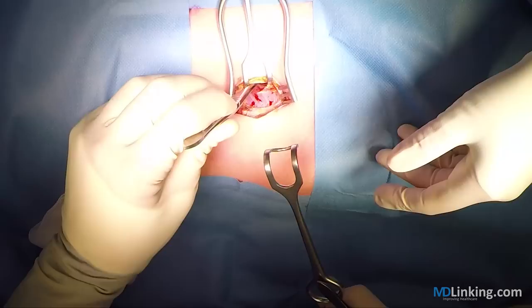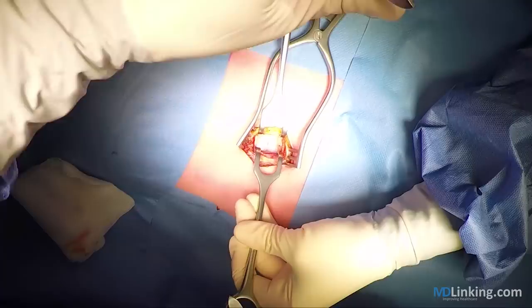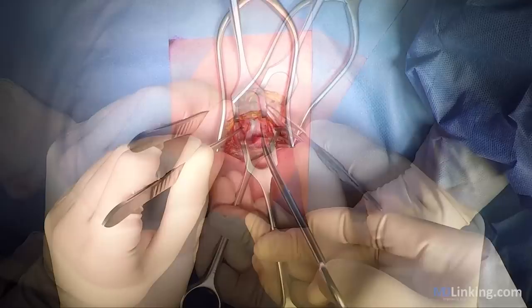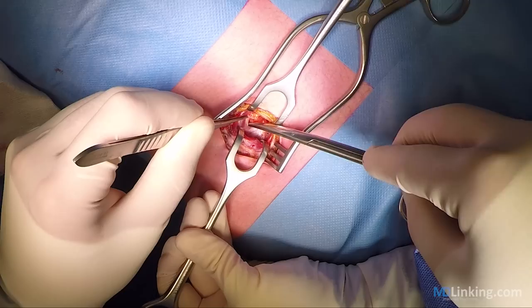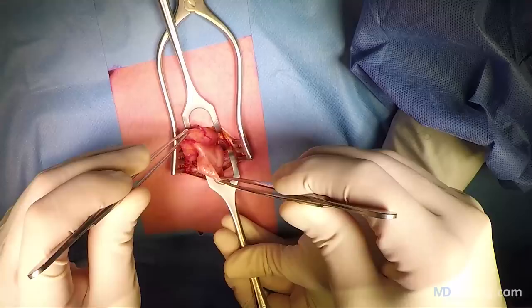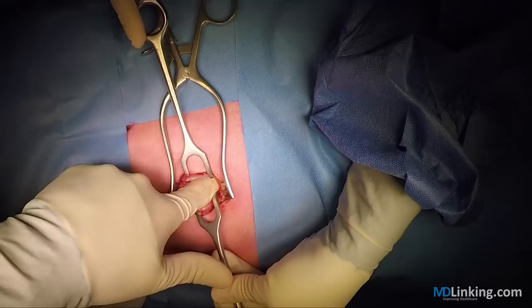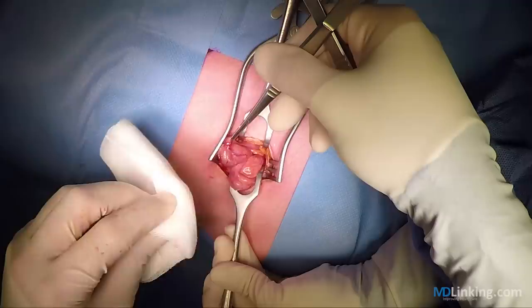So we now keep the muscle fibers aside to give a nice exposure of the peritoneum, which you can see here, and with a small cut we can open the abdominal cavity. We will now try to identify the ascending colon, which you can see here, and by following the tenia coli we will automatically find the appendix.